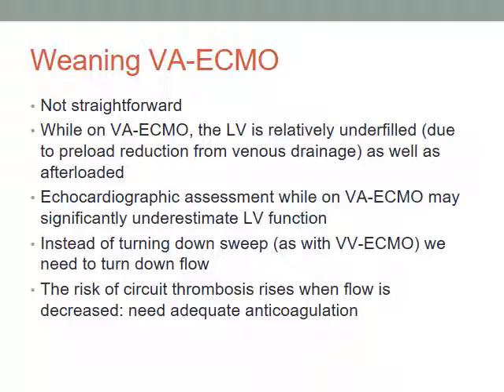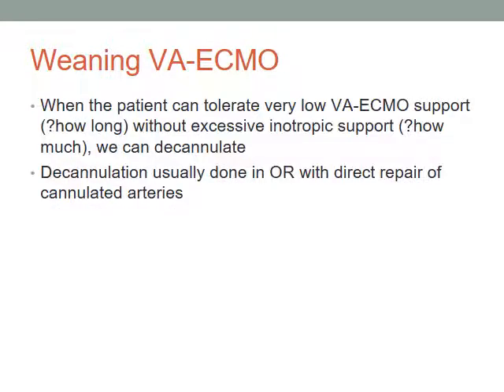As we turn down the flow, there's a risk of circuit thrombosis. So we actually have to have these patients very well anticoagulated during this period. And the question is, when the patient can tolerate very low VA ECMO support without excessive inotropic support, then we can decannulate. So how low is low, how long is long enough, and how much inotropic support is too much? Those become the questions. And again, you really don't want to decannulate and decide, nah, let's put it back on. Okay. So these are very challenging, difficult decisions.